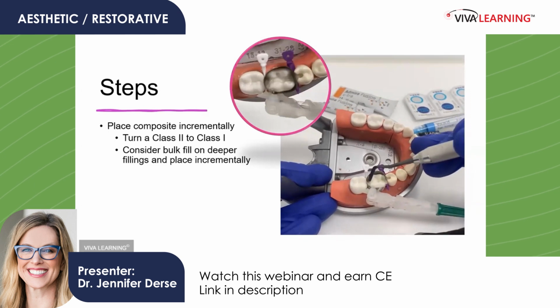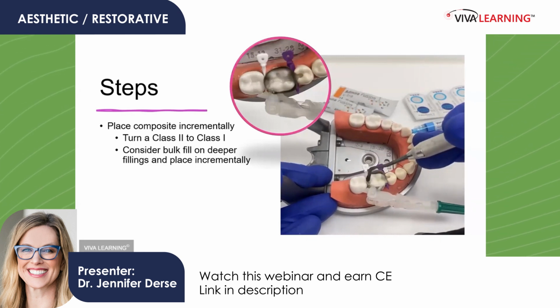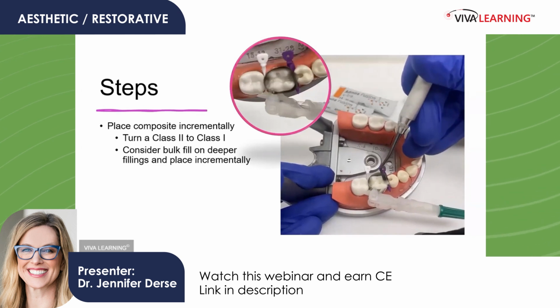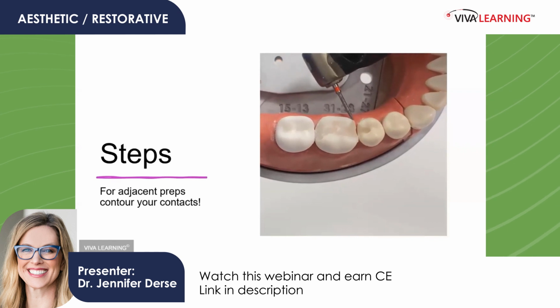And the plastic instrument works really, really well for that, for getting in there. And you can see it looks like I filled it up completely in this video, but you almost lose some of that fill because you're smushing it all the way out and making sure you're filling in those spaces. Once you remove your matrix, you might notice that, like you can see here, because the contour turned out great where I had it burnished up against another tooth, but it was a little excess on the tooth that is going into that space that's next to it.